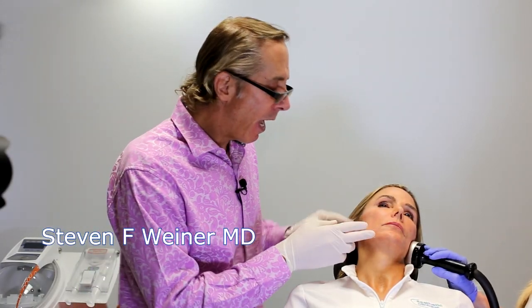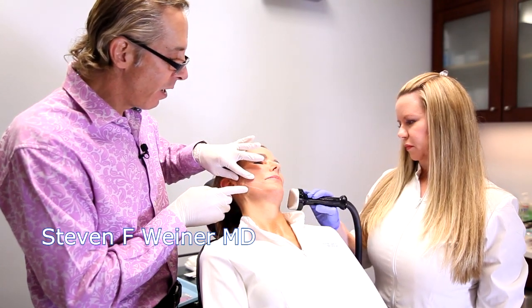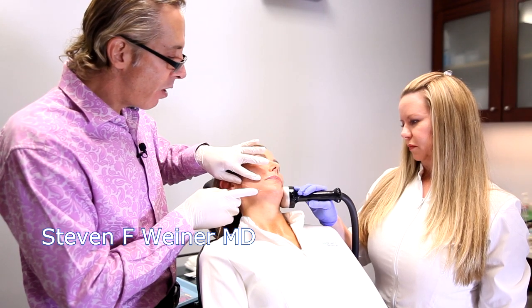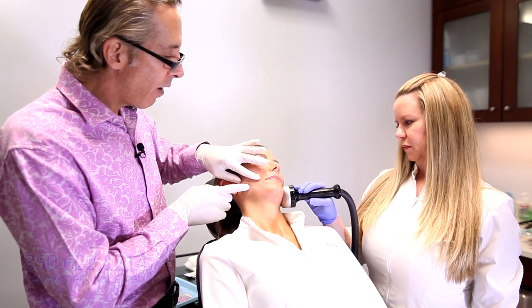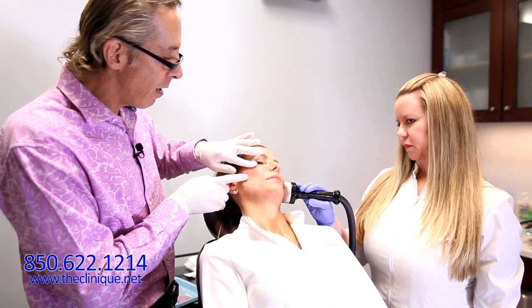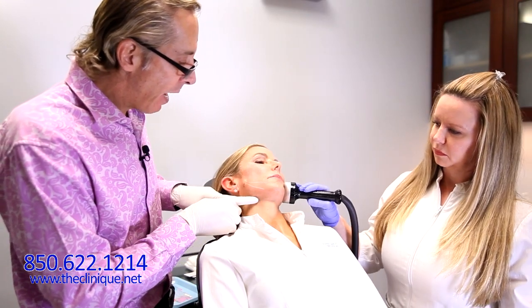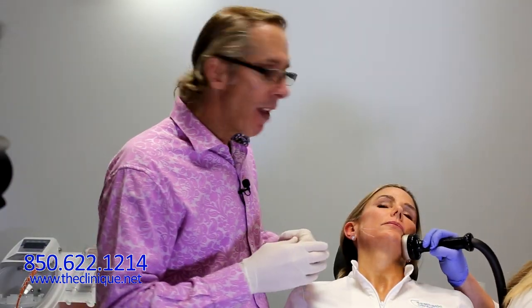And what they do is they engage the skin and can cause a little bit of lifting and tension in the skin. So the barbed threads are used in this area, in the lower face, as well as in the mid face up here. And then they're also used in the neck to tighten the upper neck. So the other areas that these threads can be used for lifting are in the knee area, in the breast area, and there's absolutely no downtime to this procedure.